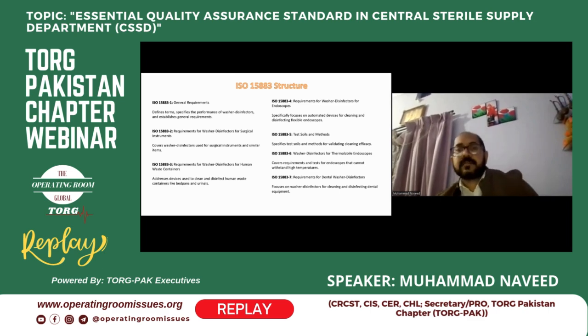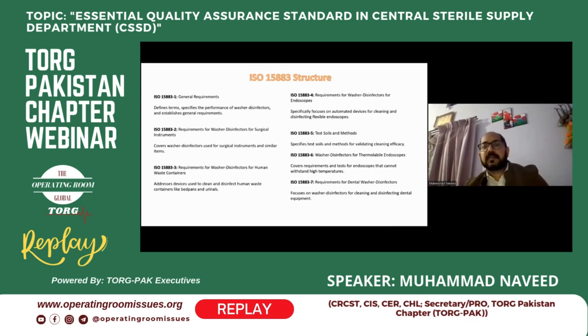The fifth one is test soils and methods. This standard tells us how we can test that soils and proteins are removed from the instruments and medical devices. The sixth one is washer disinfectors and thermolabile endoscopes.